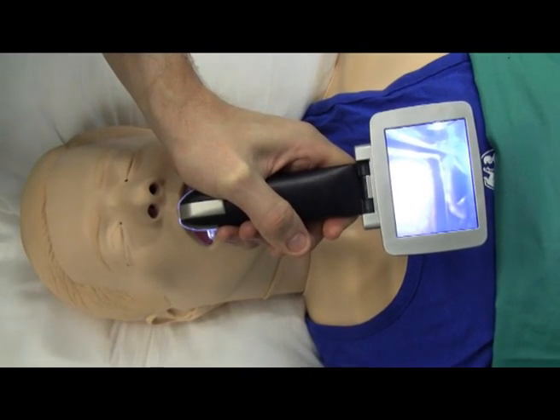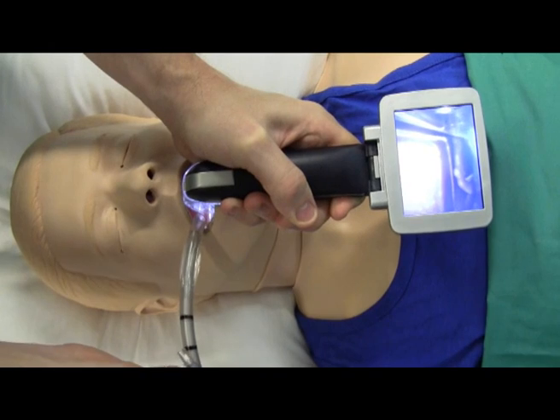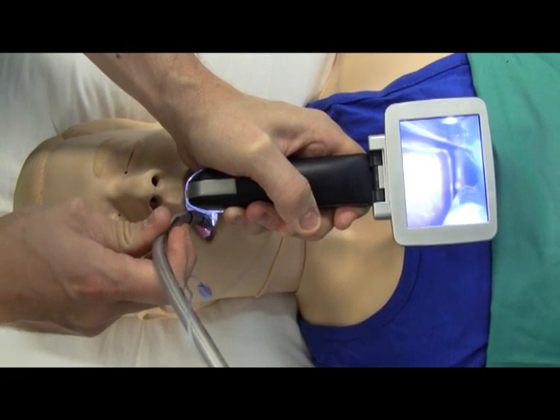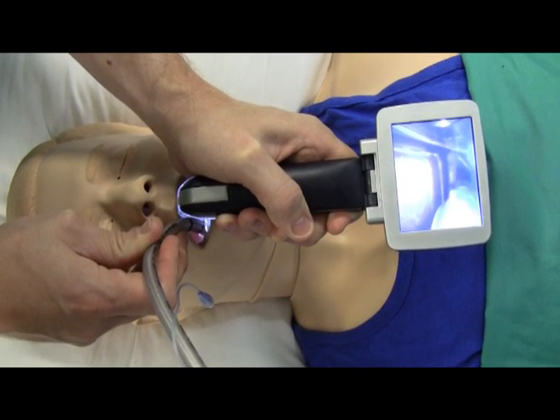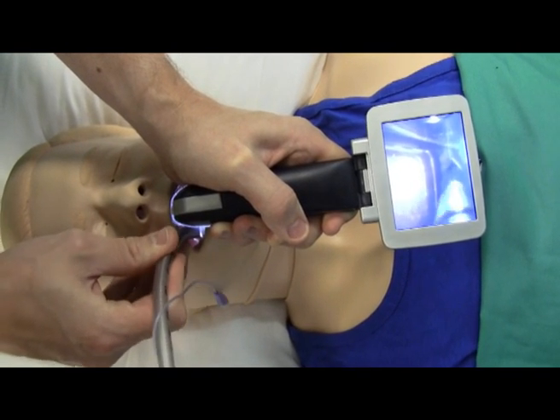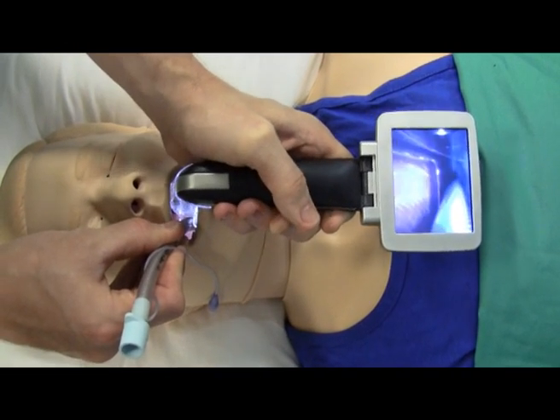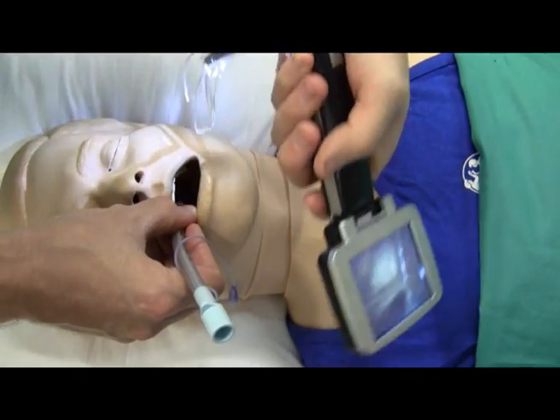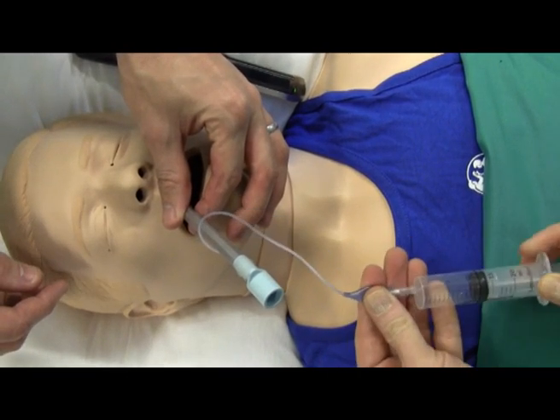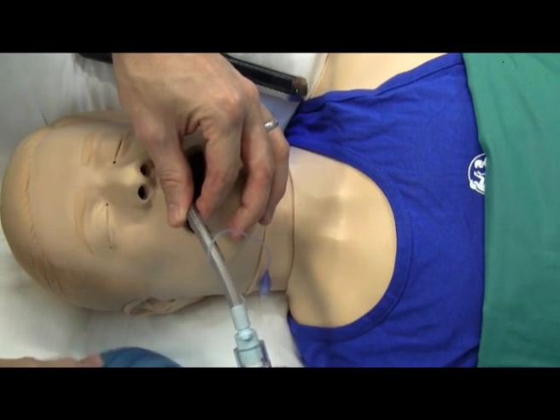Next, grab your endotracheal tube in your right hand, look into the mouth of the mannequin, and place the tip of the tube into that side channel. Slowly advance the tube and then look back at the screen. Advance the tube past the vocal cords — at this point you might need to twist the laryngoscope blade a little bit, and you can see the tube passing the vocal cords down into the trachea. Hold tight onto the tube and peel the tube out of the channel as you remove the laryngoscope. Note that we haven't used a bougie in this instance. Inflate your cuff, attach your ambu bag, and confirm that you can ventilate the lungs of the mannequin.